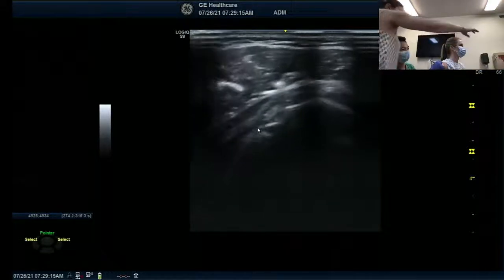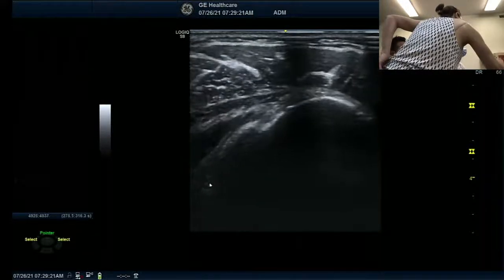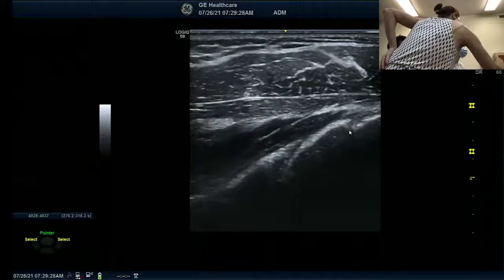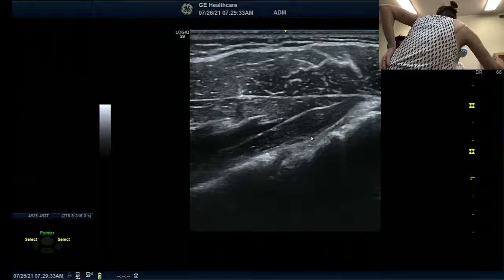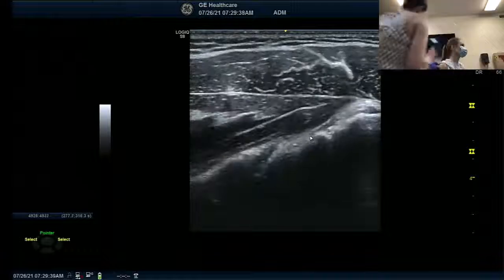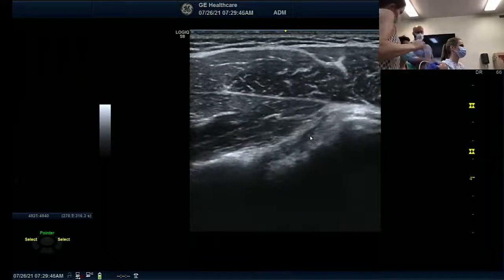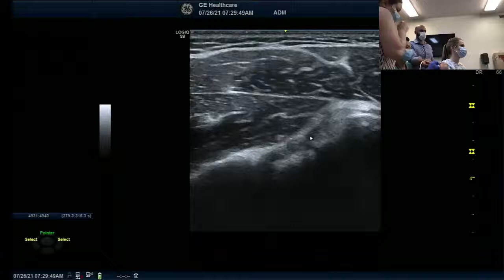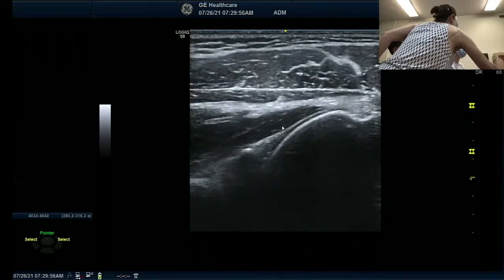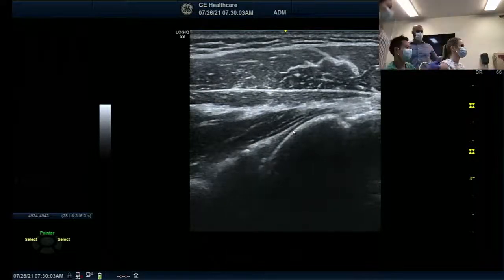So this is already the biceps tendon. If you go back, this is the joint. This is the labrum, this is the humeral head, this is the labrum — this is where you would go to inject. The best way I've done it: you come immediately and drop right down, still inclined. You'll come from here and come right above. So long as you get to that line, you're in the joint.